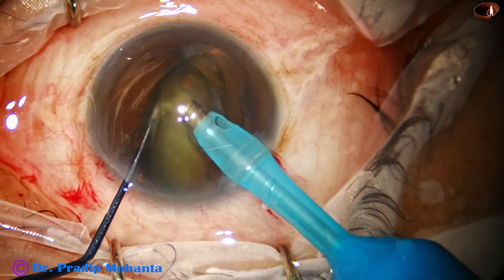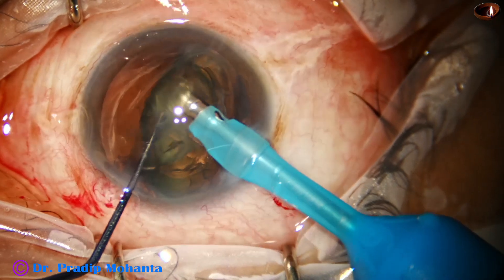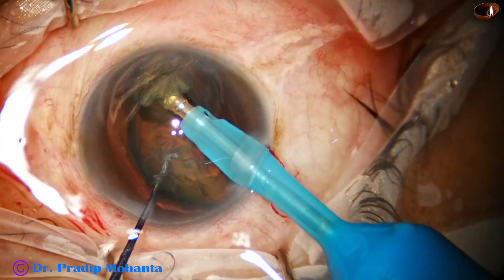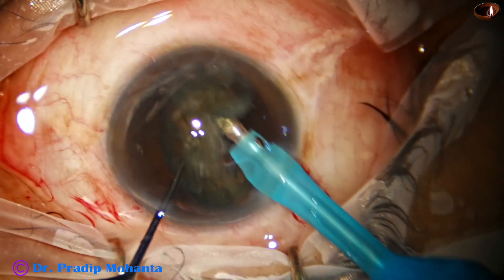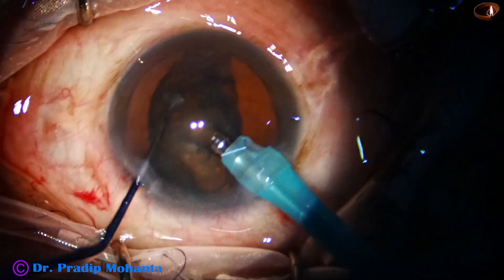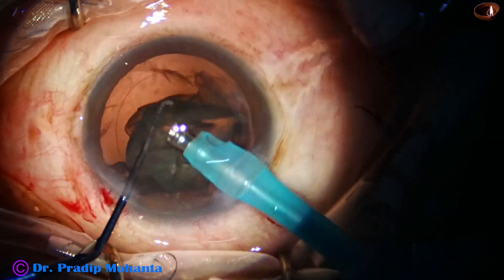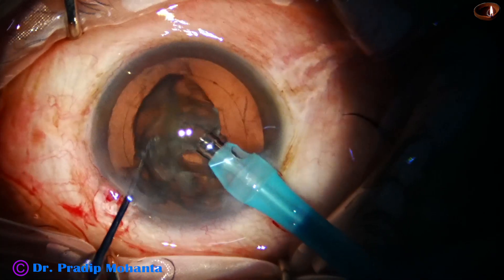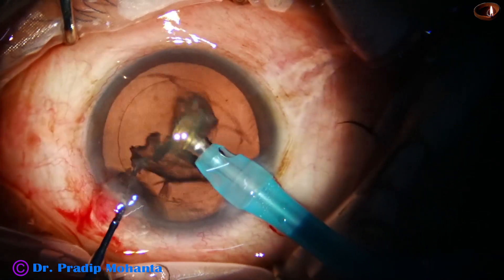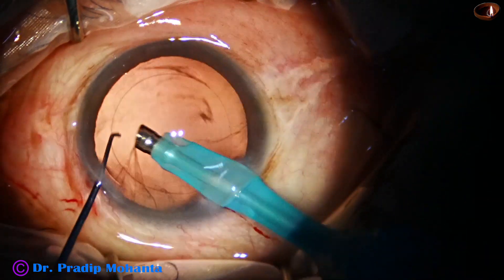Emulsification of the portion which is supracapsular is carried out — just eat up one part. Between the two instruments the remaining part is cracked like this. Then one part is emulsified, the other part is turned, it tumbles, and you just eat up from one side. In less than one minute you eat up the whole nuclear mass.